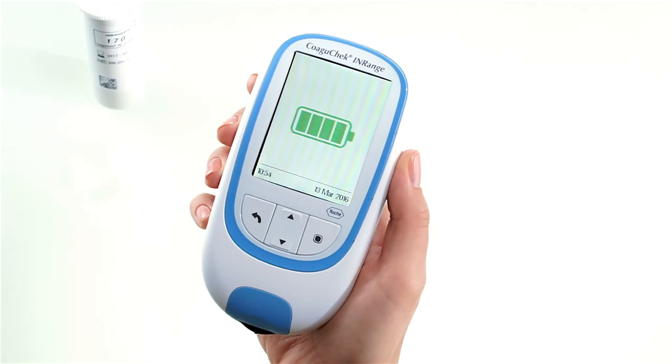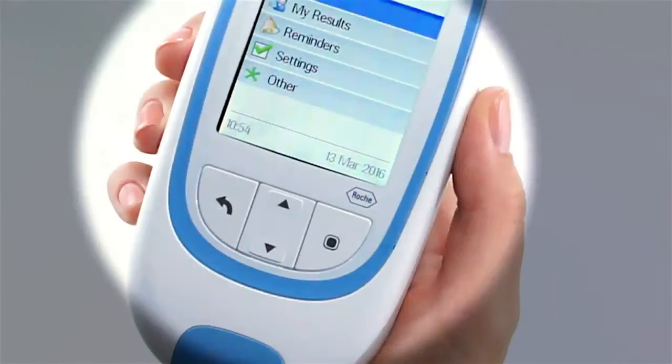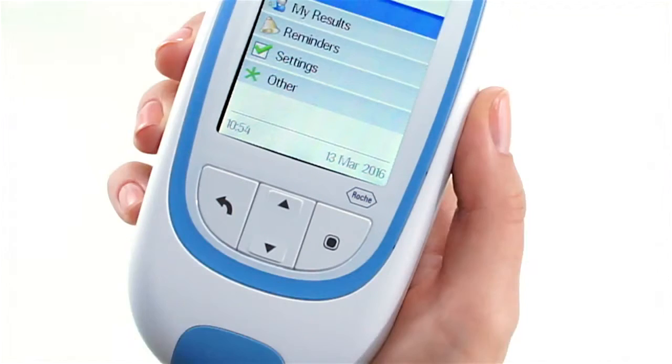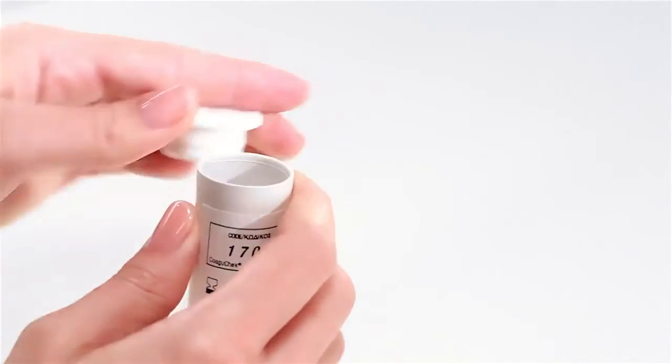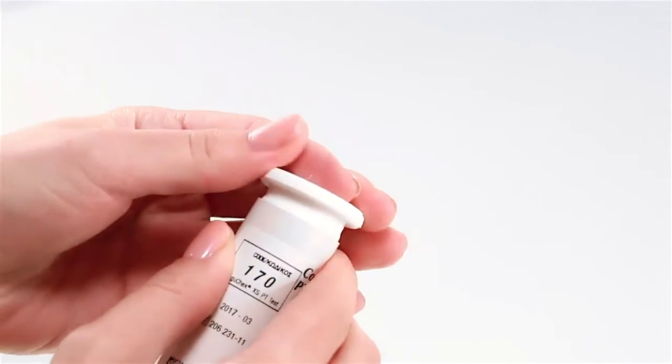Inserting a test strip will turn the COAGUCHECK INRANGE meter on and put the meter directly into test mode after startup. If the meter displays a battery-low message, you can still perform up to three tests, but remember to replace the batteries as soon as possible. Check that the time and date are correct and, if necessary, re-enter them. Take a test strip from the container and always remember to immediately close it again with the stopper to help protect the remaining strips.